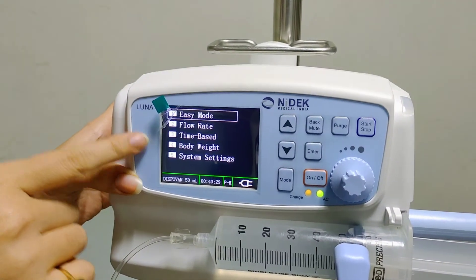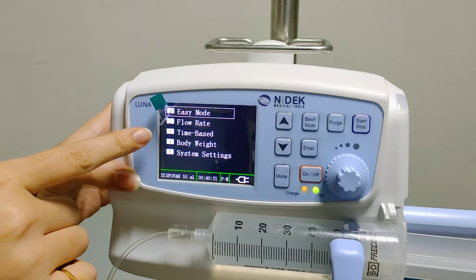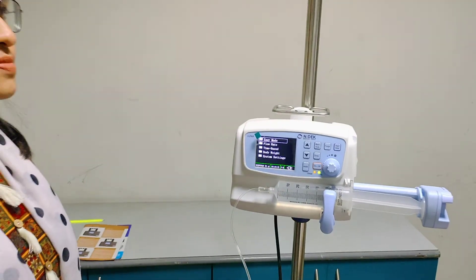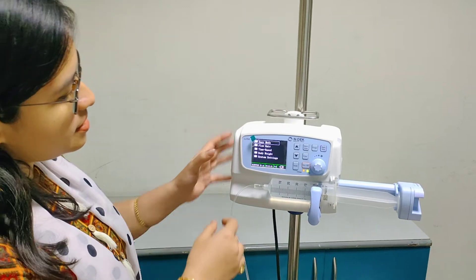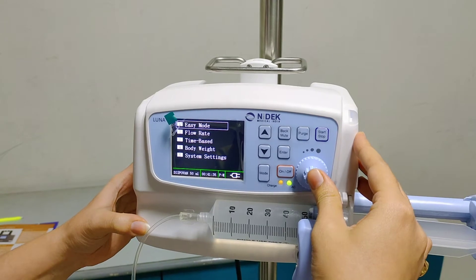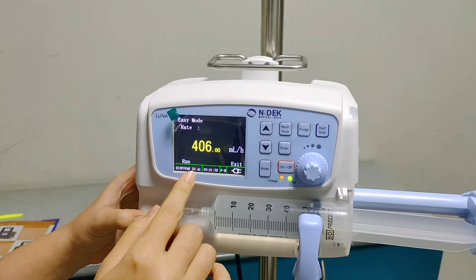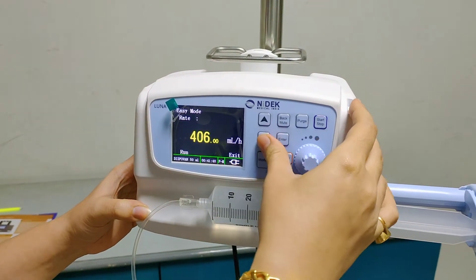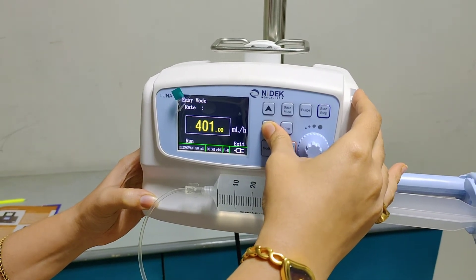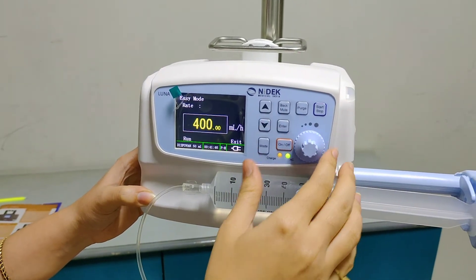You can see there are 4 modes: easy mode, flow rate mode, time based, and body weight. Now we will run the machine in easy mode. I will press the trim knob. So now the machine is in easy mode — I will just set the flow to 400 ml per hour.